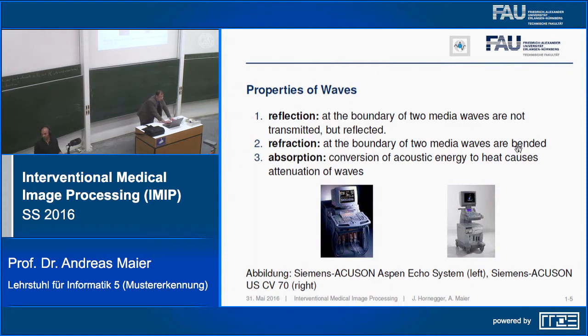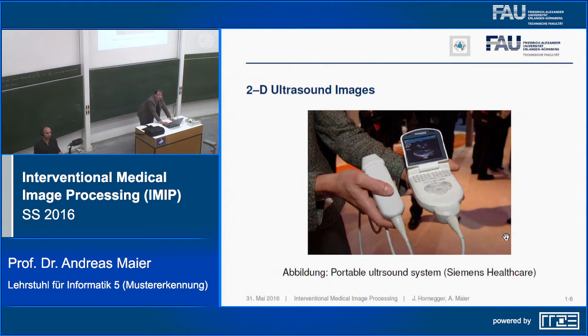Down here, you see a couple of ultrasound machines. And you can notice that ultrasound is a modality where, if you have a look at the user interface, it seems rather complicated. But people are really well used to it, and they can operate these systems very well and securely. And here you can also see a newer device of an ultrasound system to the right-hand side. There have been further developments in ultrasound, and nowadays you can even produce ultrasound sensors and also ultrasound displays that are handheld. So you can use ultrasound, for example, in an ambulance. This is also a nice thing about ultrasound.